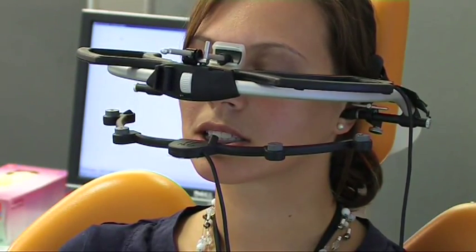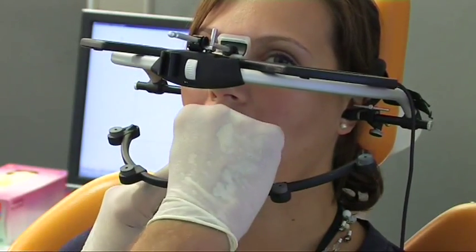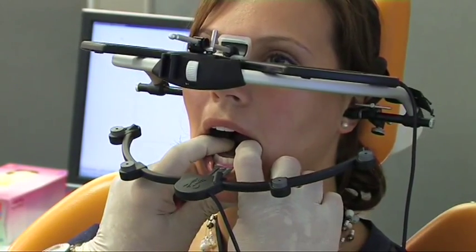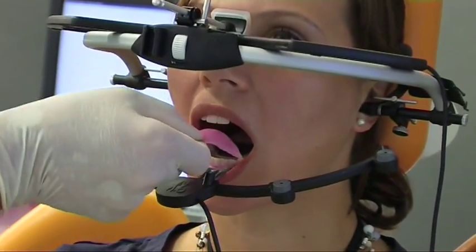Before we start measuring we must put the registration plates into position. At first the lower plate is inserted and with light pressure snapped into place. Then the upper registration plate is positioned.